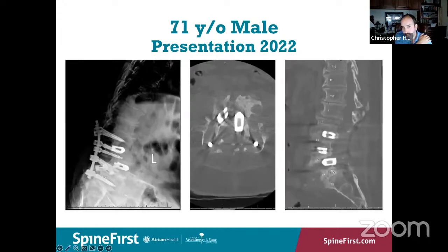At that time, we got some upright radiographs that showed retropulsion into the canal of one of the titanium cages at L4-L5, with significant lucency around the pedicle screws at L5. We subsequently obtained a CT image which confirmed the pseudoarthrosis and retropulsion, but also showed a large osteolytic defect involving the L4 and L5 vertebral bodies.